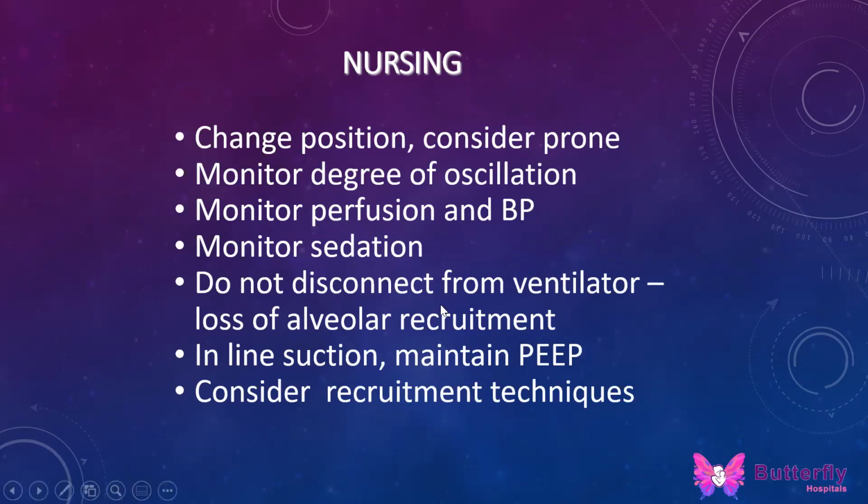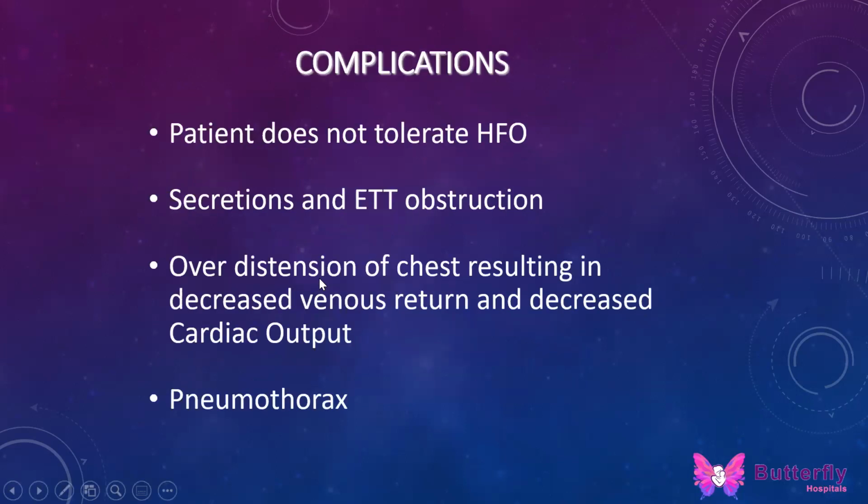And one, as I said, do not disconnect from the ventilator. You need to have a closed suction system.